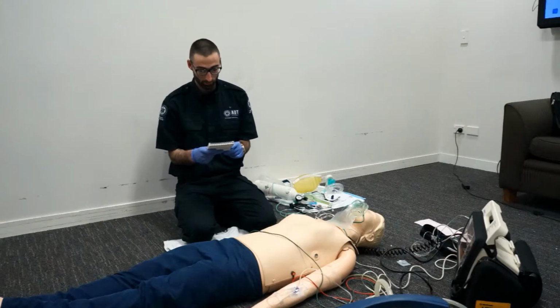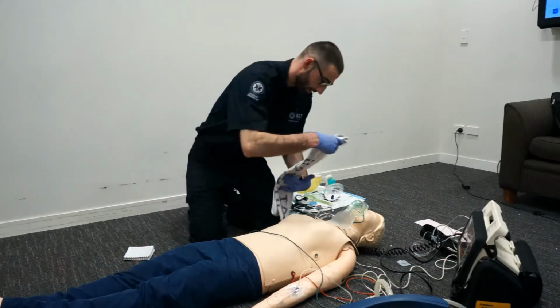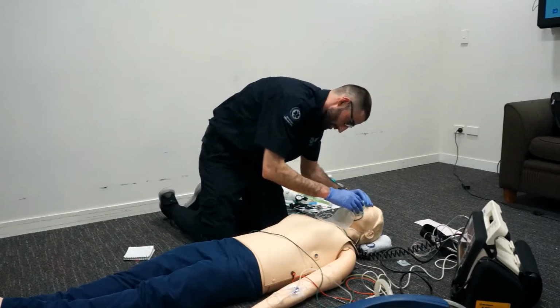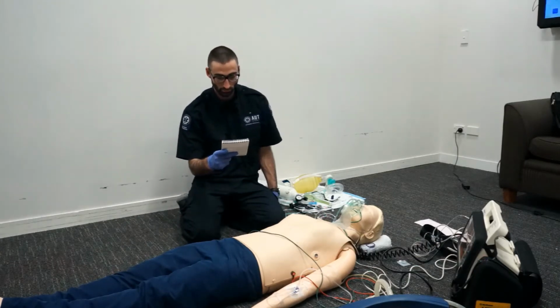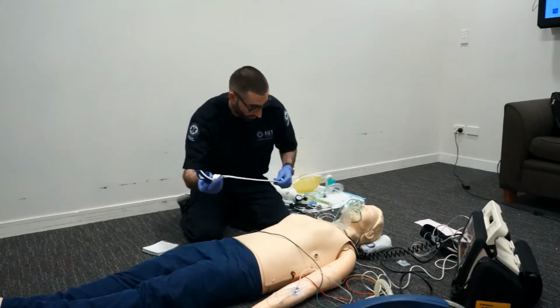Position the patient for optimal airway control. For example, consider placing a folded towel under the head. Okay, I have a towel here. Fold that and place that under the patient's head. Allowing for a good sniffing position with ears to chest. Place an ETT holder with the strap undone under the patient's head. Okay, got the ETT holder here, place it here.